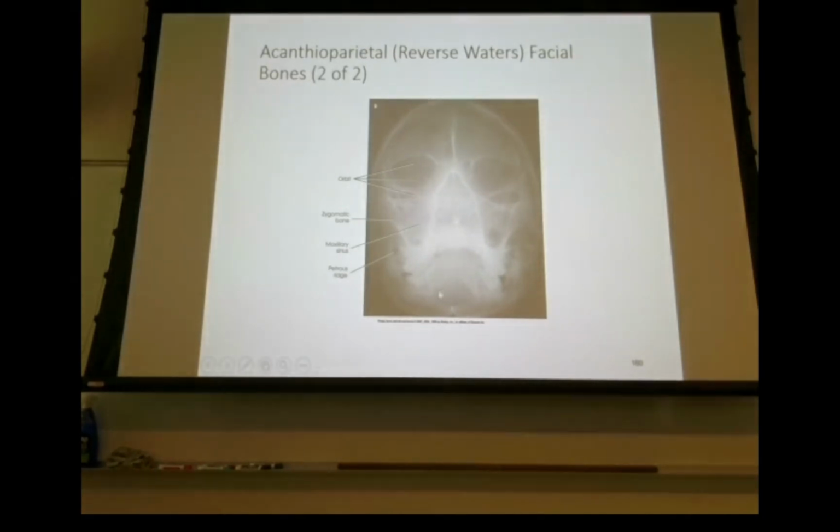Since I don't see any kind of odontoid process here, I have to assume that this is probably a phantom. You also don't see any frontal sinuses in this guy. So, does he not have any frontal sinuses? Did he have a sinus infection, or did some of the acrylic leak into the sinus? I don't know. So either this guy had a total decapitation, or this is a phantom. One of the two. I would lean towards a phantom.